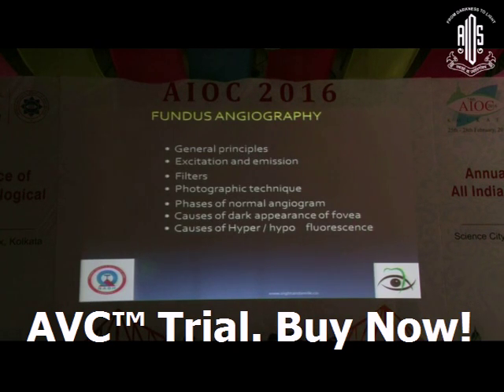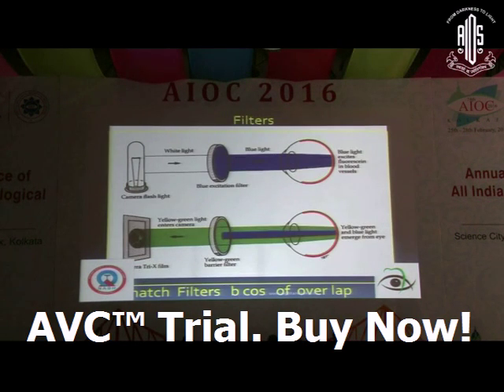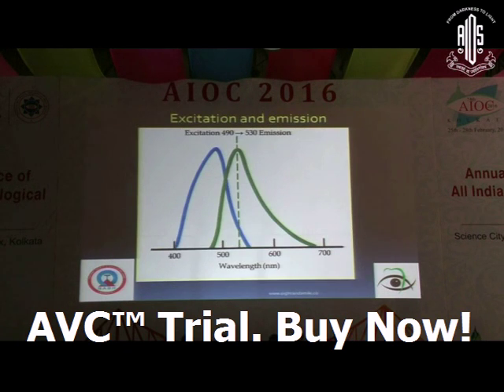Fundus angiography general principles: excitation and emission, filters, photographic technique, phases of a normal angiogram, cause of dark appearance of the fovea, and cause of hypofluorescence. That's the basic thing which we need to know. The excitation and barrier filters have been covered, with excitation at 490 and emission at 530.